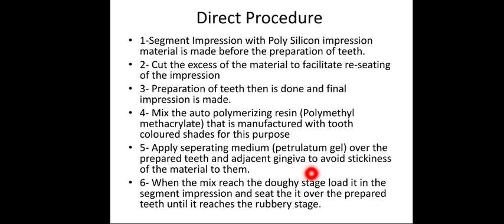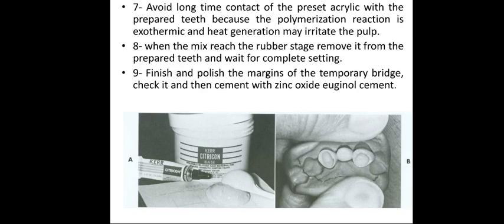When the mix of the acrylic reaches the doughy stage, it can be placed on the impression and attached to the prepared tooth to construct the temporary restoration, which can then be finished, polished, and cemented on the prepared teeth using temporary cementation material, which is zinc oxide eugenol.